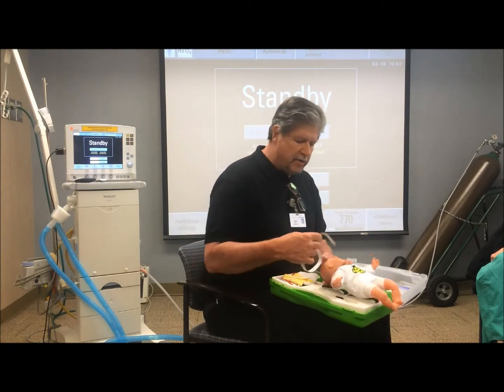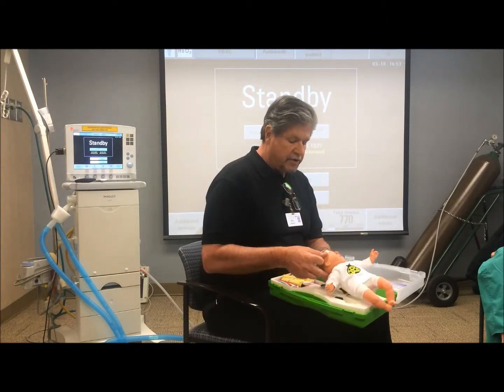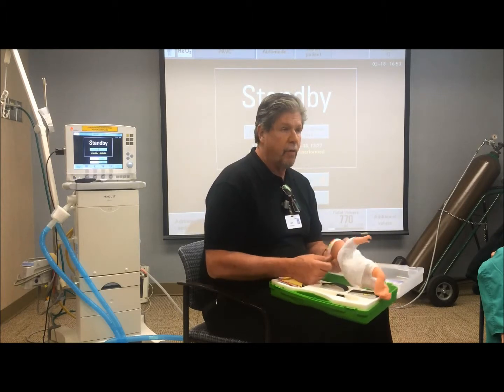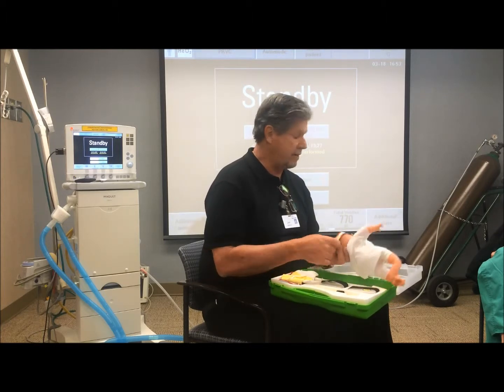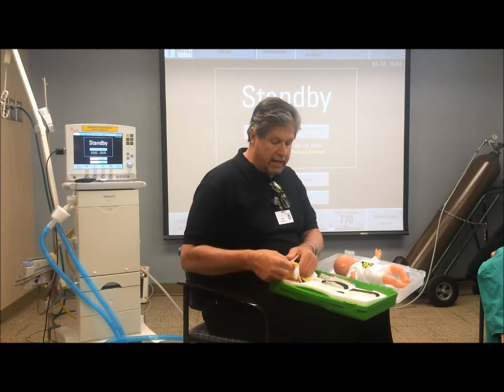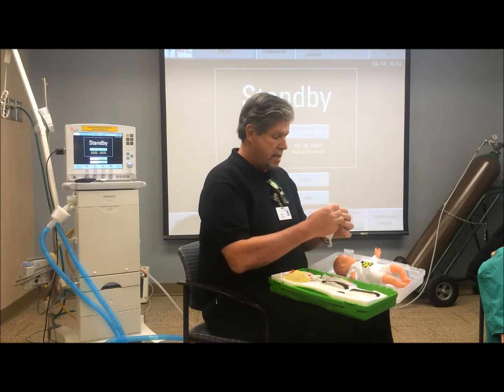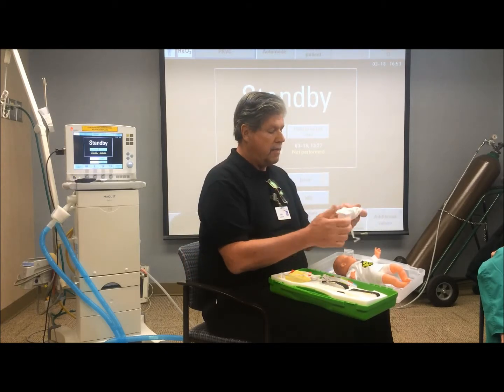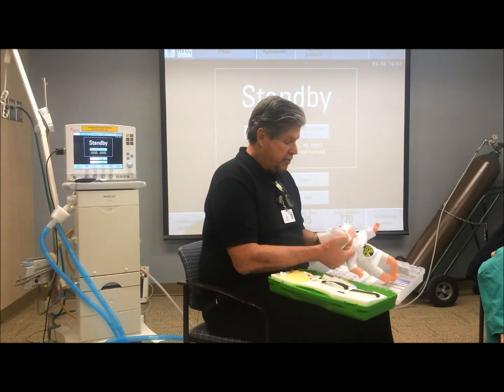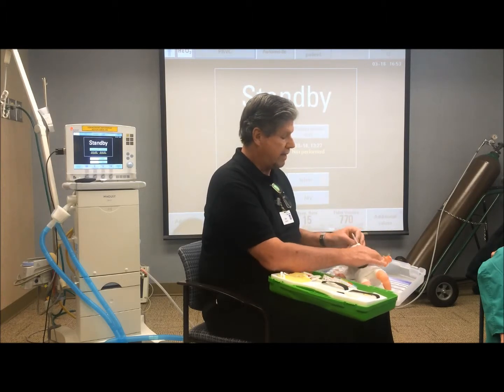So the way you do this is you simply use the tape measure to measure first, and then you find what color would be appropriate for this baby's head. Okay. So once you find the color, then you find the bonnet size or the head size that would be the right size, and then this part goes up top, on the top of the head, and we just put the little stocking cap on, like that.